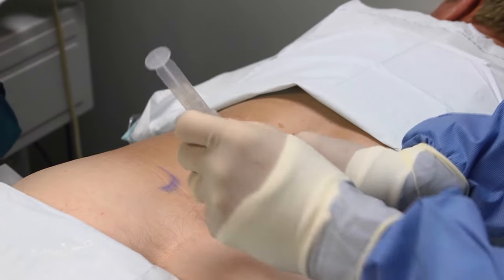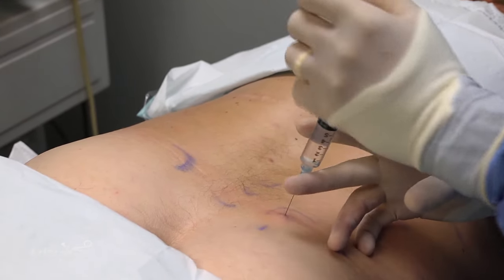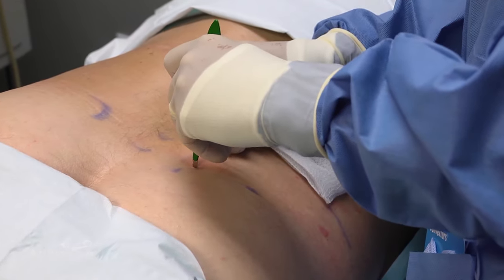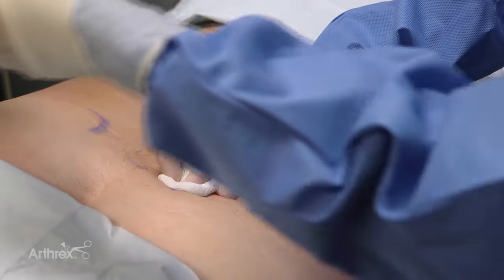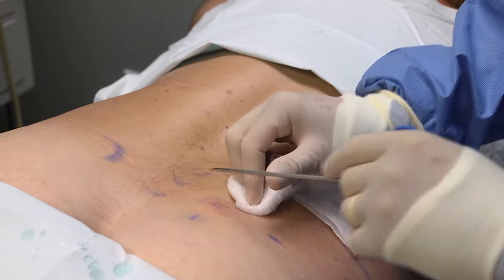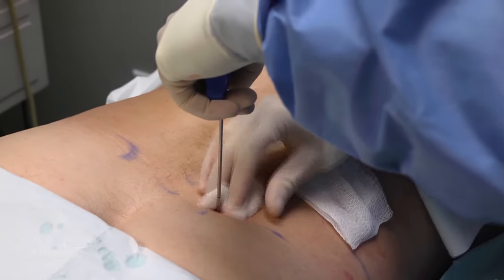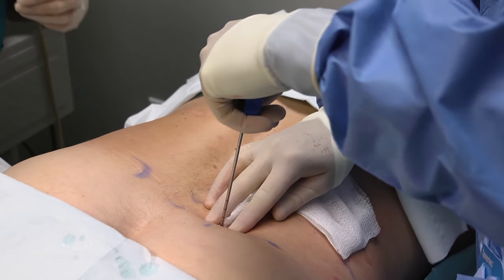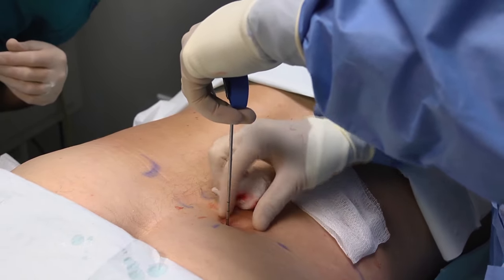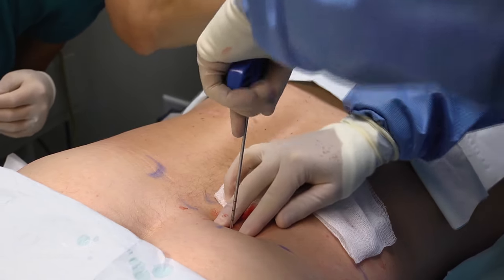I'm going to ask for a second syringe. We're just going to do a little skin wheel — that's actually usually the worst part. We're going to make an 11-blade poke hole here and grab our 12-gauge bone marrow aspirate needle, which has already been pre-heparinized. Right where I'm sitting on the crest, I see three centimeters of access on my needle. I want to pre-gauge that as I start going into the bone. I felt that the self-drilling tip is in the bone, and then I can start changing my angle whichever way I want to go.